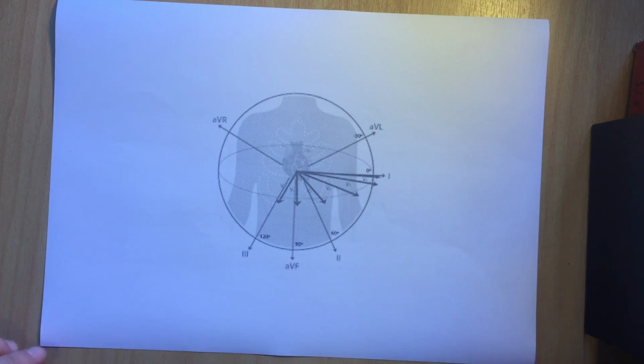So what is an ECG? Well, it's an electrical recording of the heart. And so we stick a bunch of electrodes, those dots, onto different places of people's bodies. And those electrodes record what the heart is doing, and from that, the computer that makes the ECG constructs things we call leads. What leads are is that they are angles of looking at the heart's electrical activity.